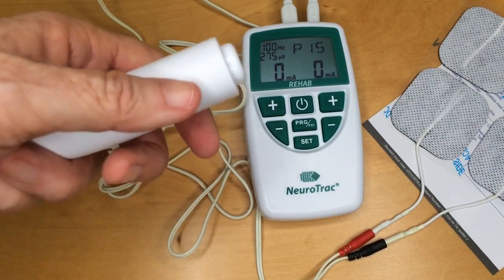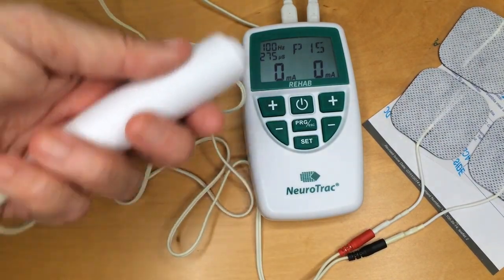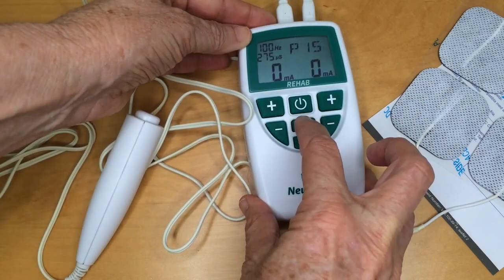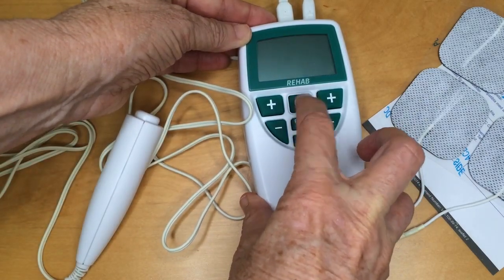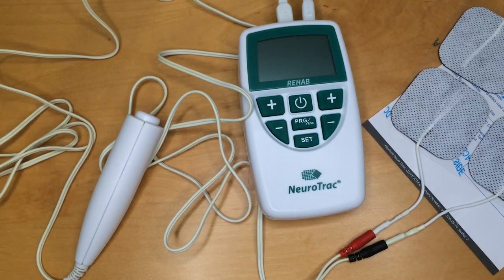This is great for if you want somebody to open their hand or reach at a particular time. When you finish your session, simply turn your device off. And there you go — that's unboxing the Neurotrack Rehab. Until next time, see ya.